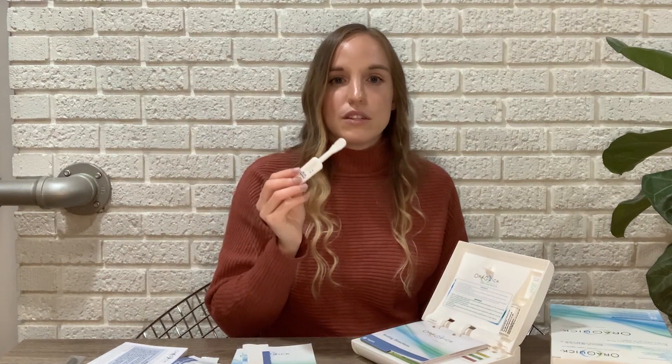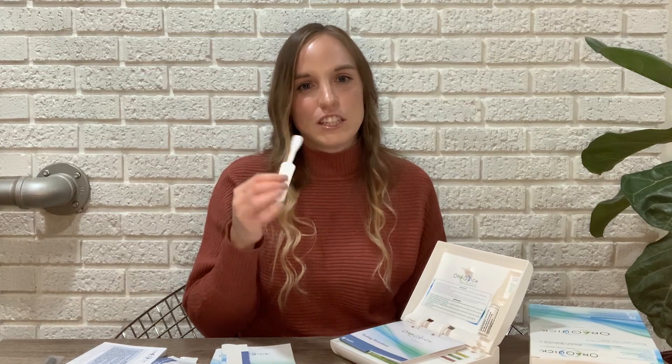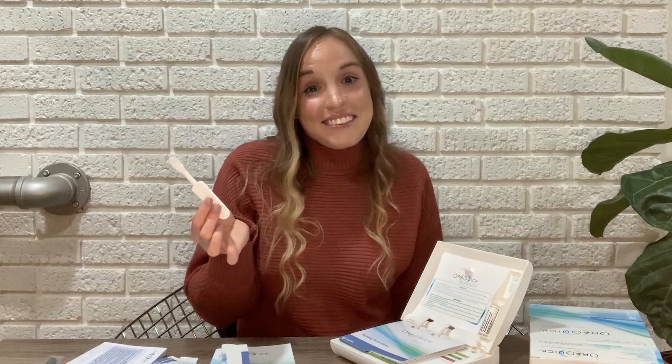Now just run the test stick on your upper gum, and then swipe it once across your lower gum. And that's it.